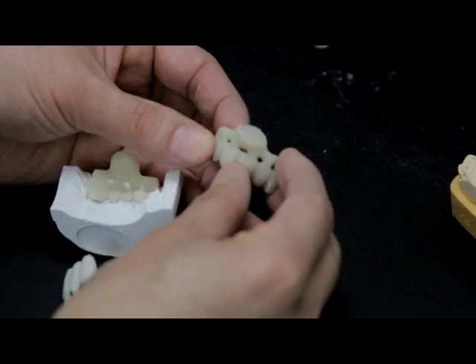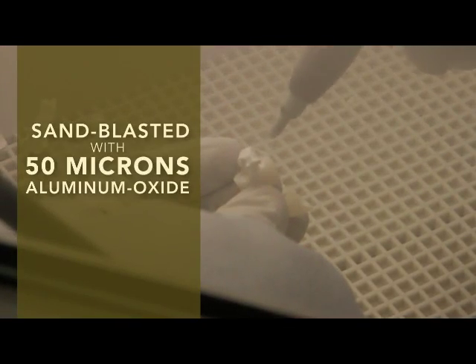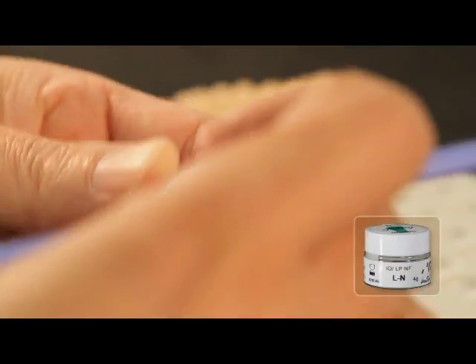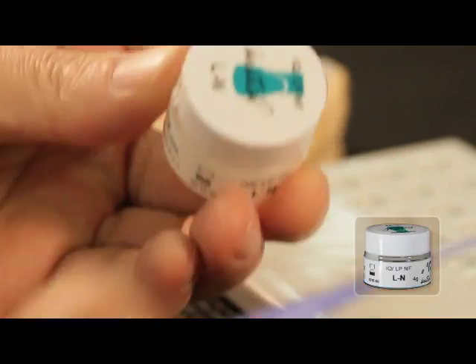After this process, the finished crowns and bridges are sandblasted with 50 microns aluminum oxide at 1.5 bar pressure. The Lustre Paste Neutral is then coated on the entire surface of the sandblasted restoration. This coating is clearly thicker than what we know from a normal glaze firing.